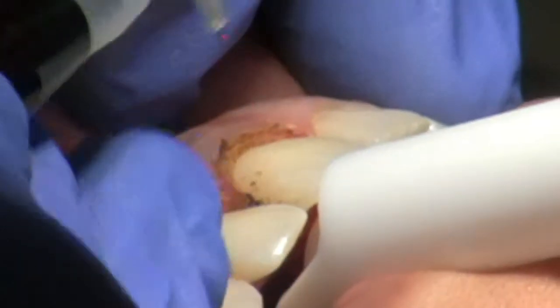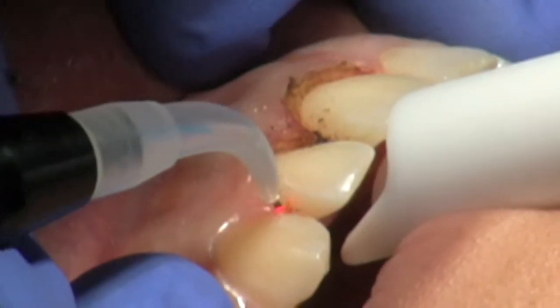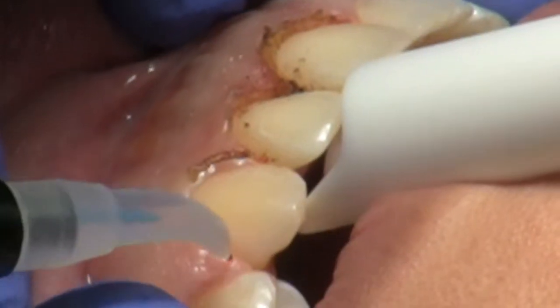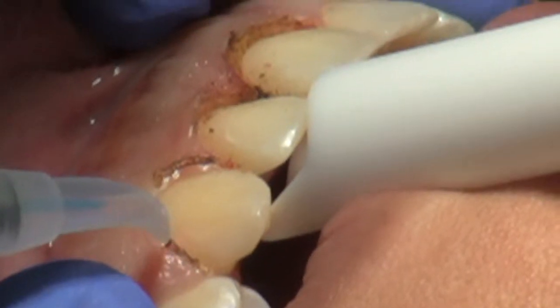I know the cusp needs to be done now, because this cusp should be as high as it should. If I ever feel myself shaking a little bit, I just stop and go somewhere else.